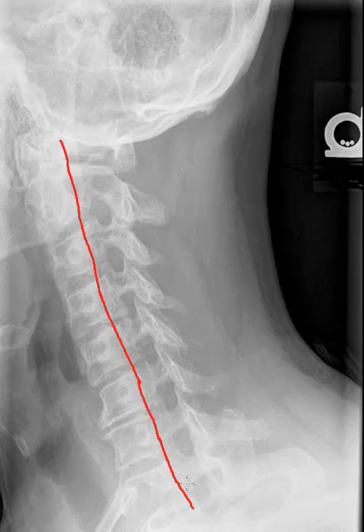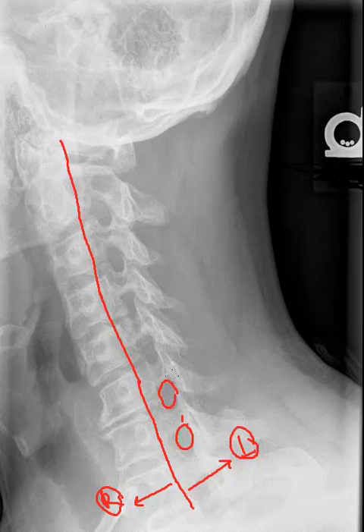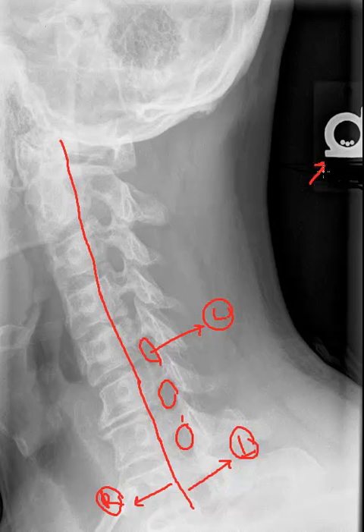As you can see very well, this is the left side of the patient, while this is the right side of the patient. This will help us tremendously. Here are the intervertebral foramen — these nice lucent holes you are visualizing along the posterior-most aspect of the spine. Notice that these intervertebral foramen are located on the left side of the patient, as indicated by the radiographic marker. Therefore, these are left-sided IVFs.